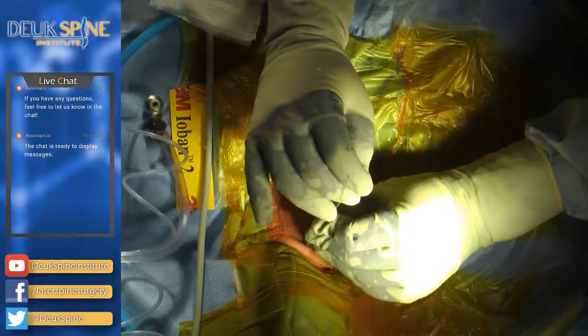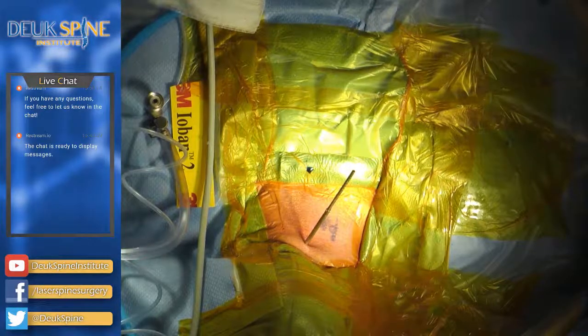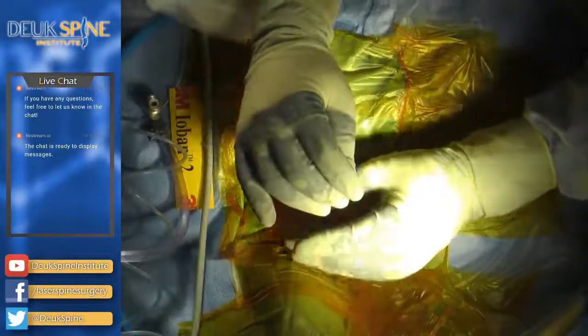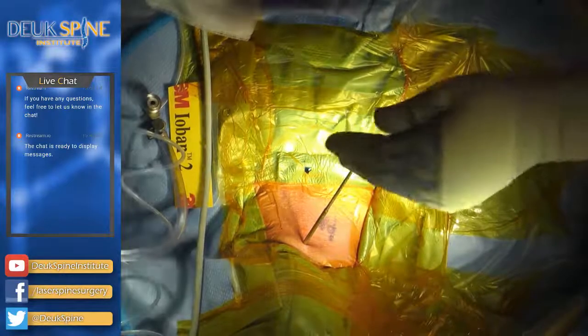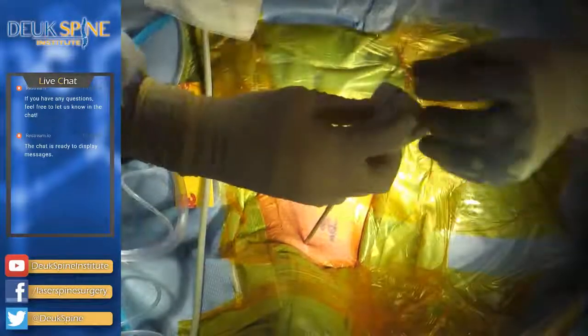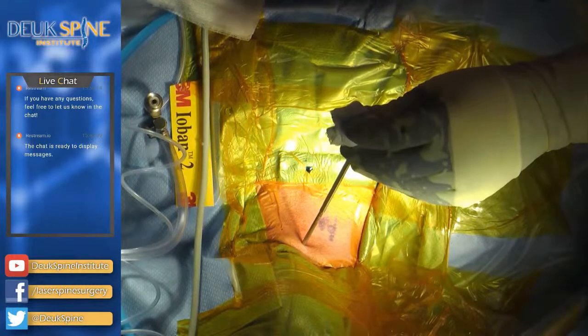All we're doing is we're spreading the jelly, okay? So we're using the dilator to literally spread the jelly apart. Imagine sticking this thing in a jar of strawberry jam and then taking it out. There's no damage to the jam at all. It just spread it open. So we're able to do the surgery atraumatic to the soft tissues because we're not opening the soft tissues in the neck. All right, here we go.